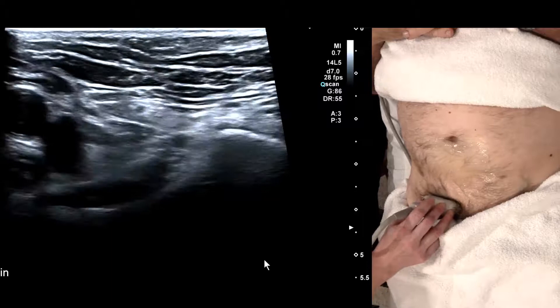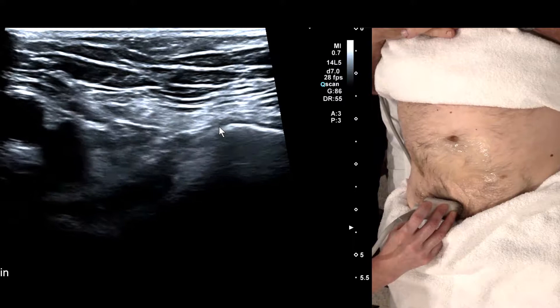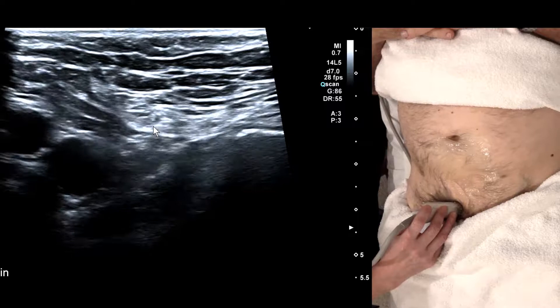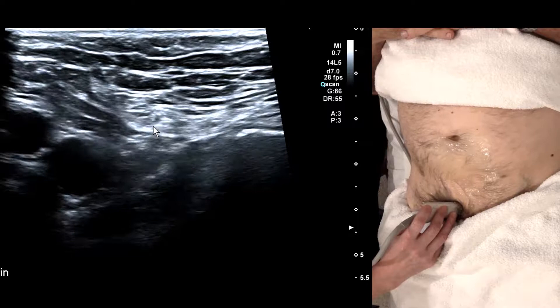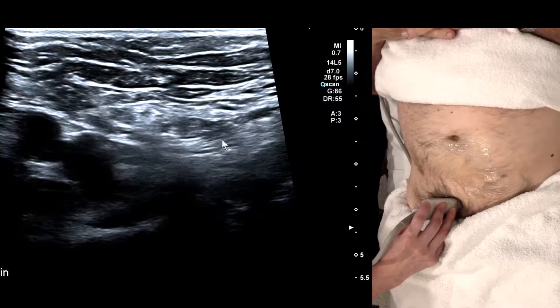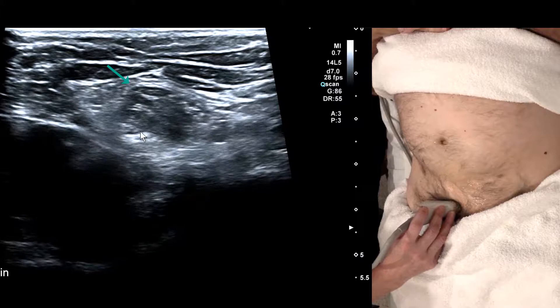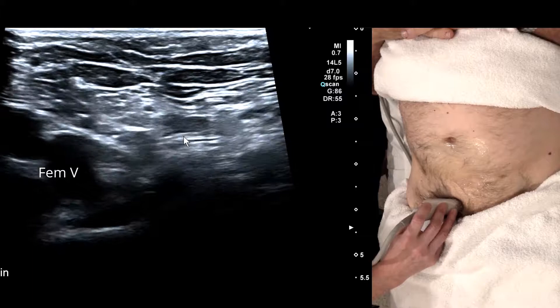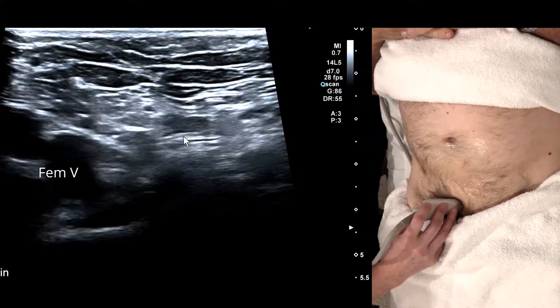A transverse approach can also be useful when looking for indirect and direct hernias. Start with the camera on the pubic tubercle, then look immediately supralateral to the tubercle - we can see the spermatic cord and vas deferens. Take the pressure off and you can see the vein, which gives away the location of the superficial ring. You can see the inguinal ligament behind. Moving immediately above the superficial ring, ask the patient to strain while keeping your eyes at the level of the peritoneum - the cord is displaced and something else is entering the inguinal canal.